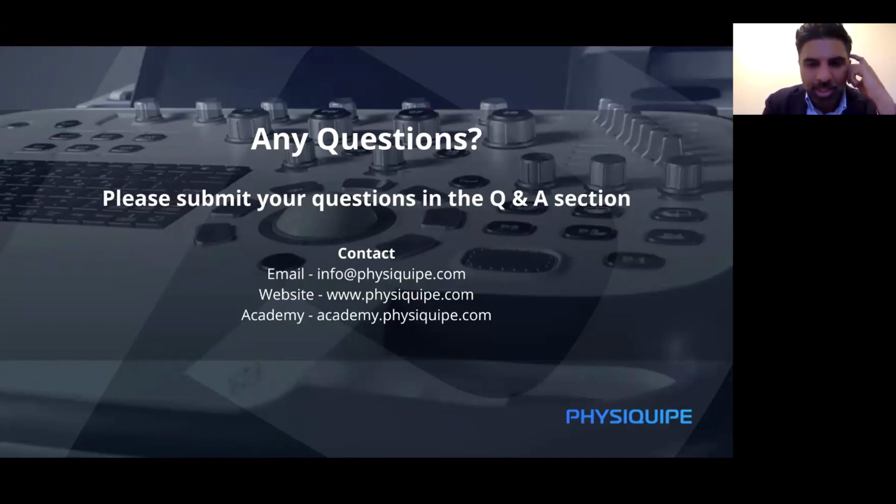Yep. So yes, I think there may not be overwhelming evidence that it can improve from this point of view, but it is about meeting the NICE standards. Then I know that some other people have looked at cost effectiveness of ultrasound as well. And what they found is that because you do ultrasound in one sitting, you give them the diagnosis, it reduces all those other hospital appointments. You can see other people in that time, and there's quite a significant cost benefit as well.